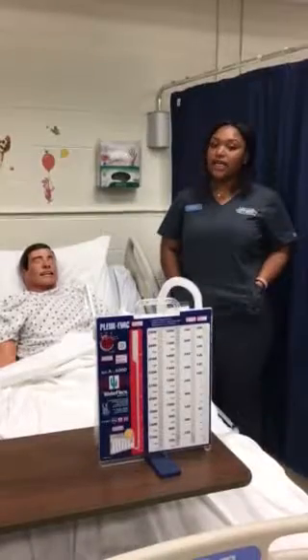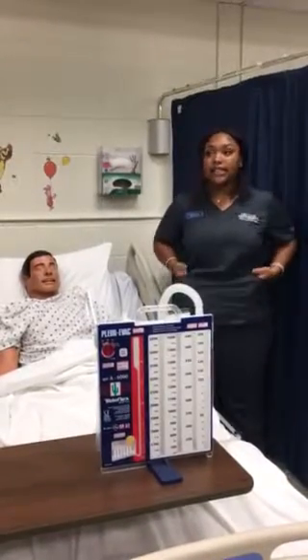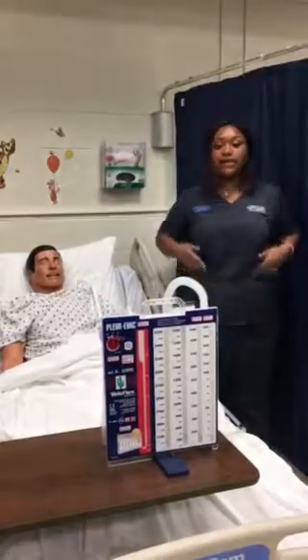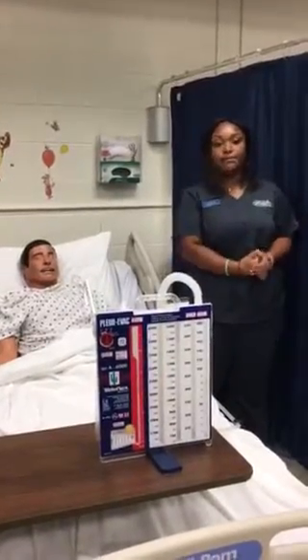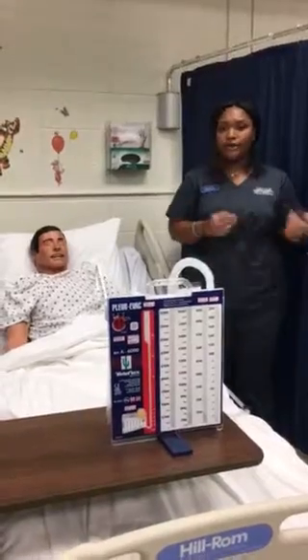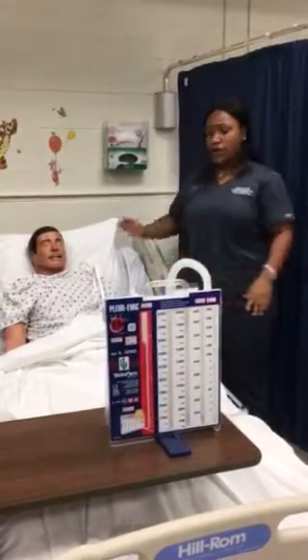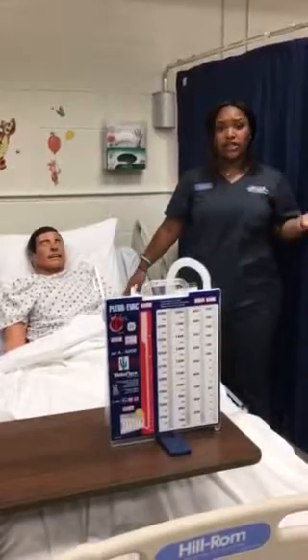Today is August 29th, 2018, and it is approximately 11:35, and today I'll be expanding on chest tube drainage and care. So to start off, I will go check my physician's orders, go into the patient's room, introduce myself, check my 2 patient identifiers, and then I'll begin to explain.